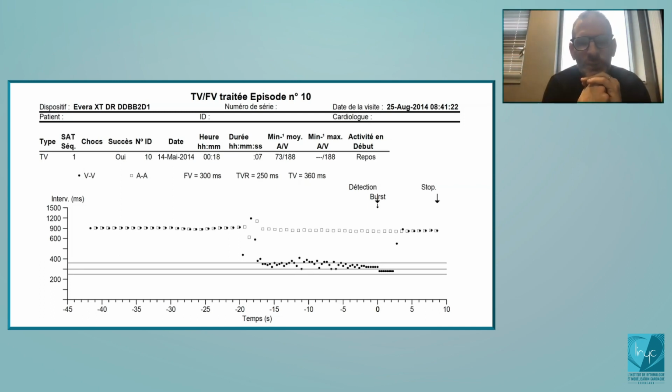So the PR logic is considered as very difficult to explain, but I think you can explain it at the end. Maybe not give all the details on how it will work, but I think it's very easily possible to explain it. And what is important is to understand in which situation there's going to be the PR logic and the wavelets, or the PR logic only. So in all the patients I will show you, we will consider that you have programmed both the PR logic and the wavelets.